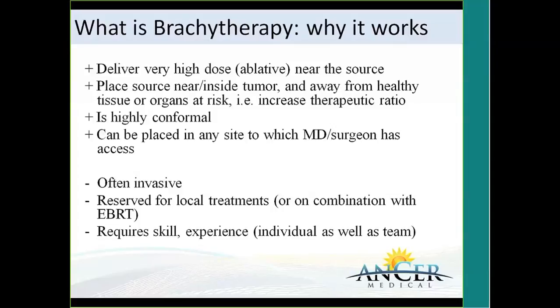So this makes this type of radiation highly conformal, as opposed to external beam therapy, where radiation is coming in from the outside, and you have to tailor the beam or use arcs or many beams to be able to get a highly conformal treatment. With brachytherapy, it is inherently conformal.